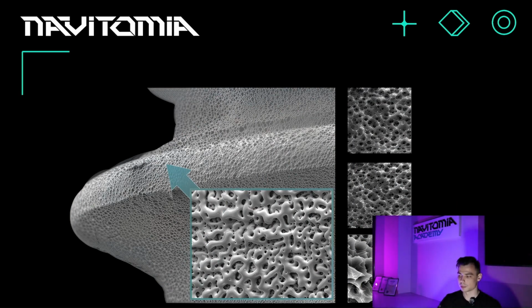And implants are not just a metal pin that is inserted into the bone and stays there forever only because of the thread. Rather, you could say it's a unique phenomenon, which I believe was discovered by Brånemark in the 1950s, and it is associated with what is called osseointegration. If you've ever held an implant in your hands, you might have noticed that it is matte and rough.